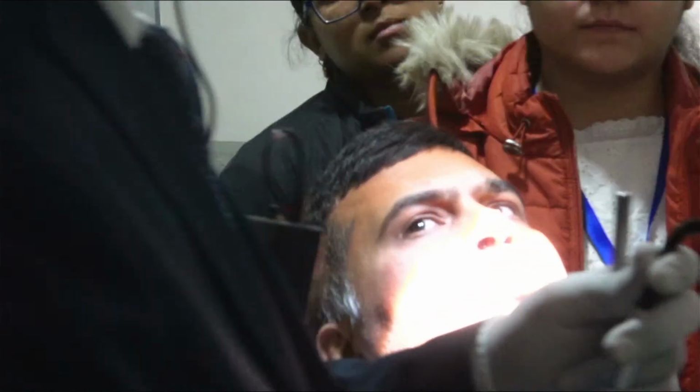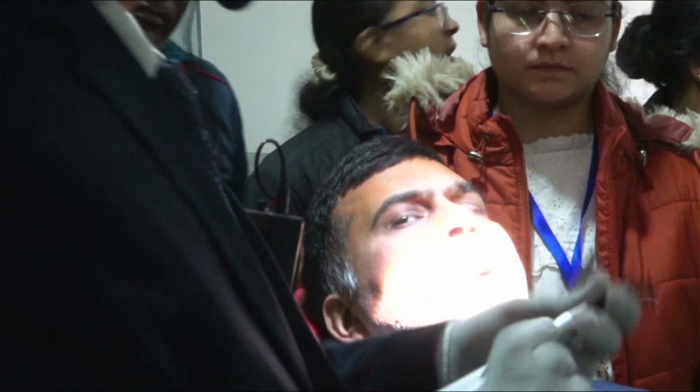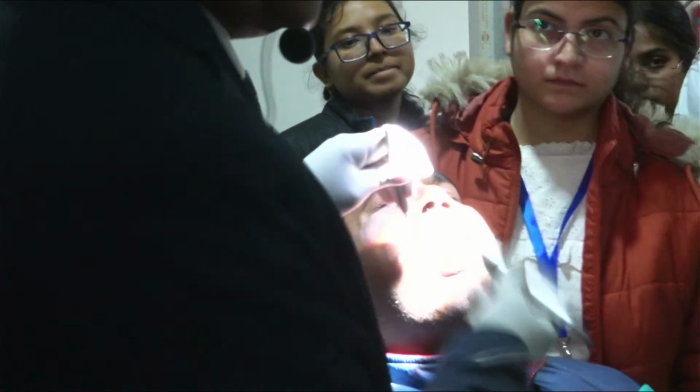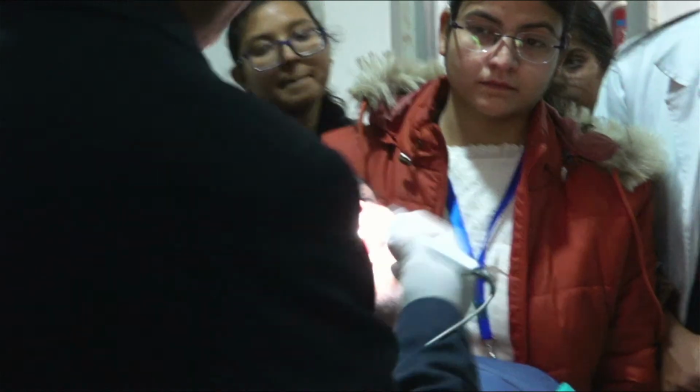kill, right? Photosensitizer has to be used for the PDT to be effective. Only putting the PDT will not be effective, right?